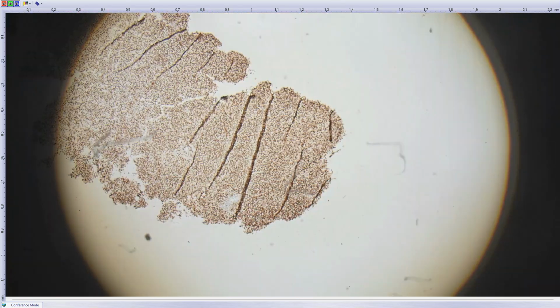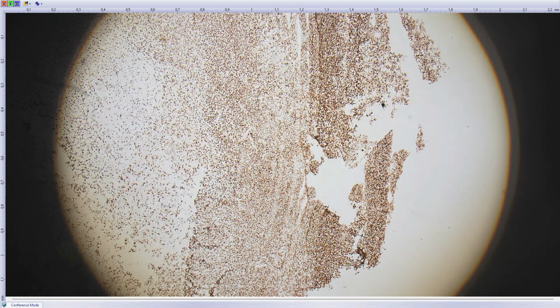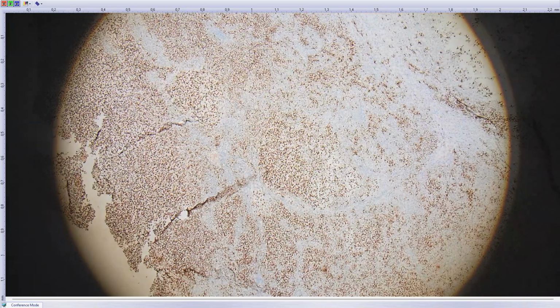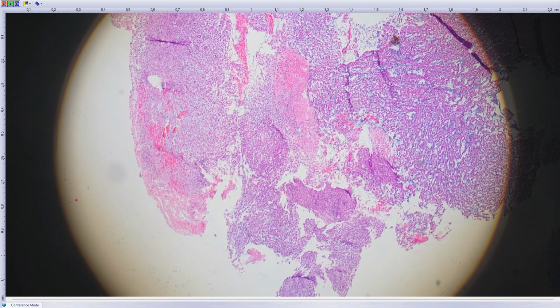Basically, dedifferentiated liposarcoma is the absolutely number one choice. If it was somewhere close to the heart, you could consider intimal sarcoma. If it was in the bone, you could theoretically think of some osteosarcoma, but those are usually low grade and don't have morphology like this at all. So in this location, almost certainly dedifferentiated liposarcoma.